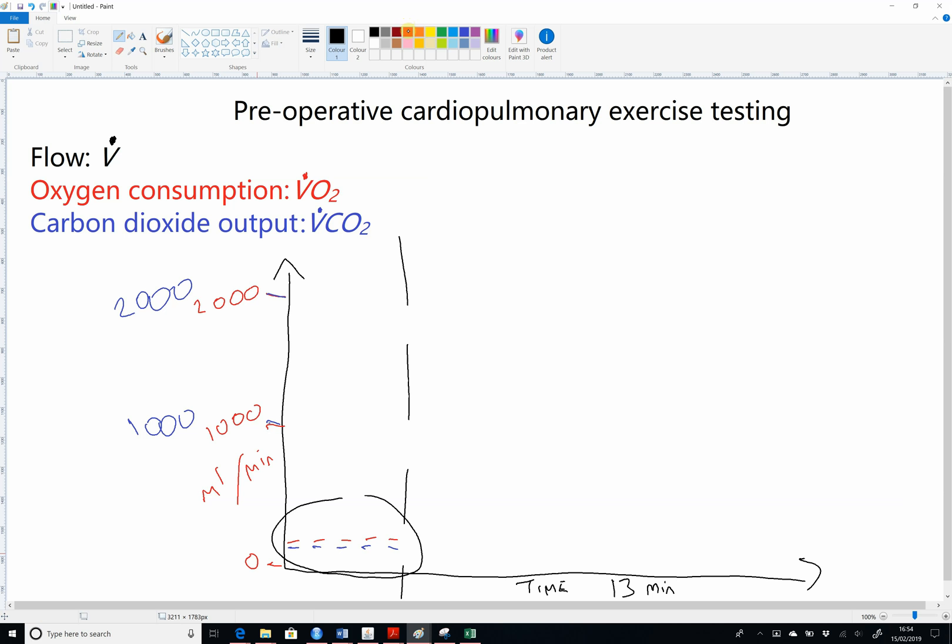The amount of oxygen this person is breathing sitting on the bike is more than the amount of oxygen they are using at rest. At rest would be lying on the ground not doing anything. The average oxygen consumption is 2.6 milliliters per kilogram per minute, which is less than what is termed one metabolic equivalent or one MET. One MET, metabolic equivalent of task, was just a scale designed to easily compare different activities, often at home, but it doesn't have a physiological basis.